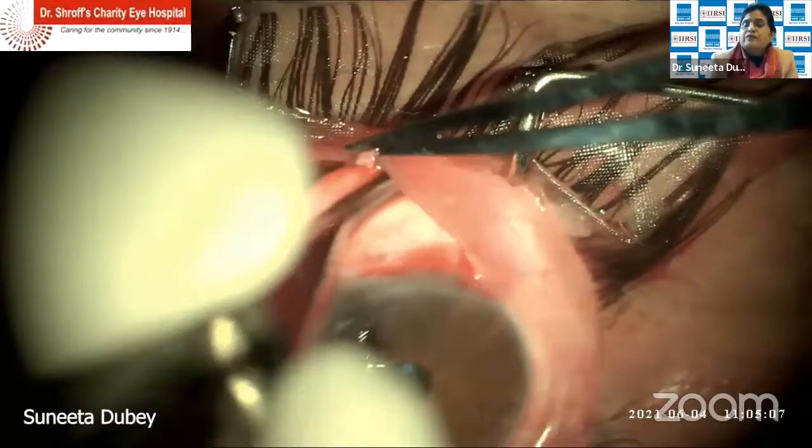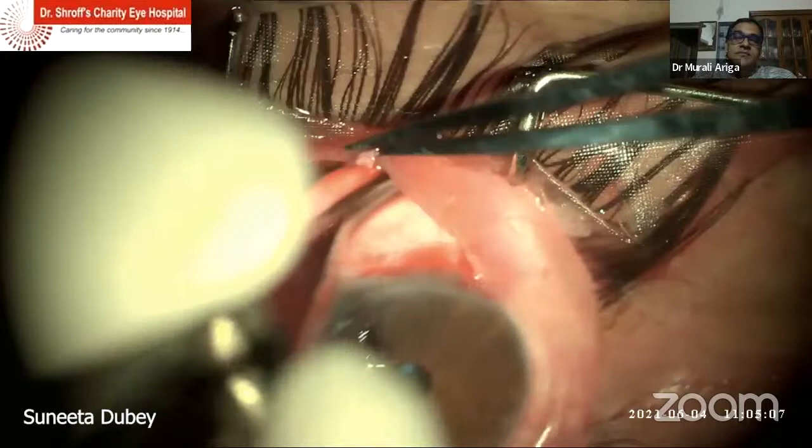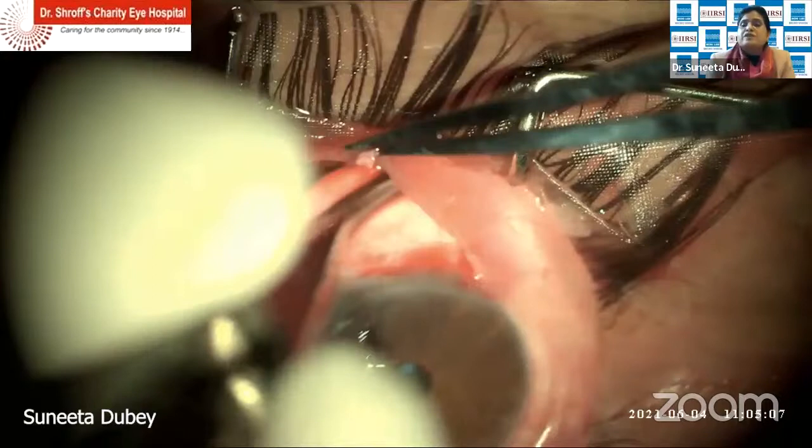So I agree with Dr. Murli. Even in very high myopes, if you use a very short time, very low concentration of MMC and put in a lot of releasable sutures and try to prevent hypotony, it can work, because Ologen is expensive. But there are certain indications where you can use it.